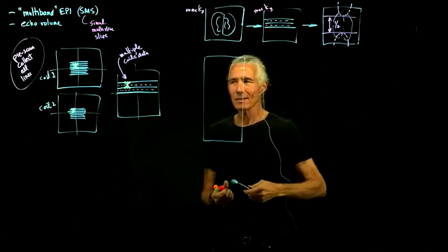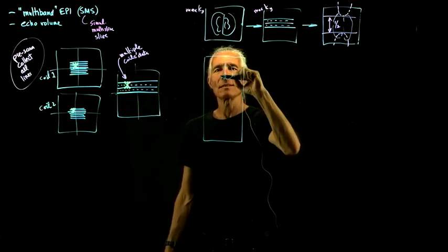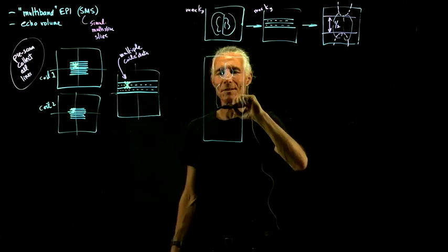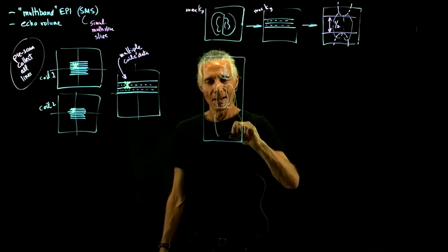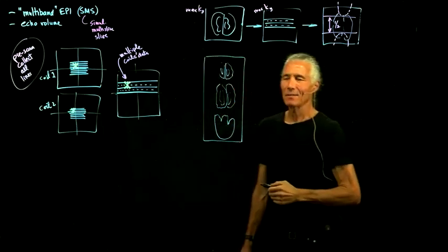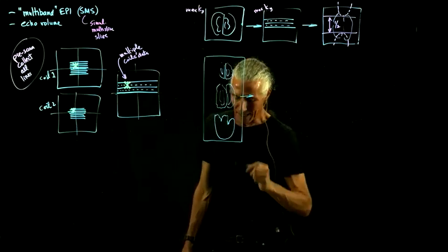So it almost looks like we had a real situation, which was, say, 3 slices. So we had like 3 slices like this. Okay, say this was the real world. It's obviously not the real world because there's only one brain in there, but say we had a situation like that with 3 completely unoverlapped slices, and we collected data on it.